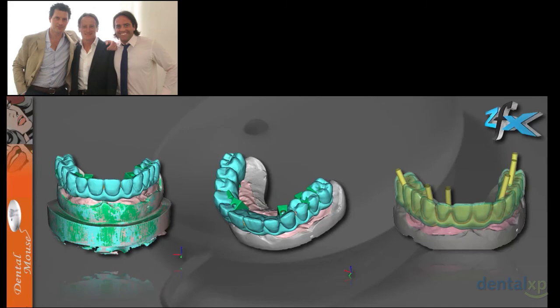And here you see the implant position, but then you can evaluate the implant inclination, so you can evaluate where it's going to come out on the final restoration, whether you want to do a screw-retained restoration or a cement-retained restoration, for all of your implants.